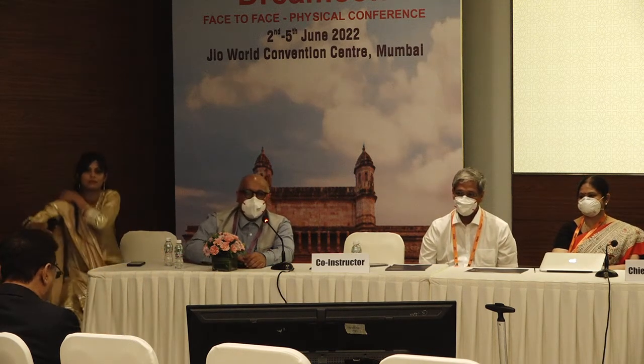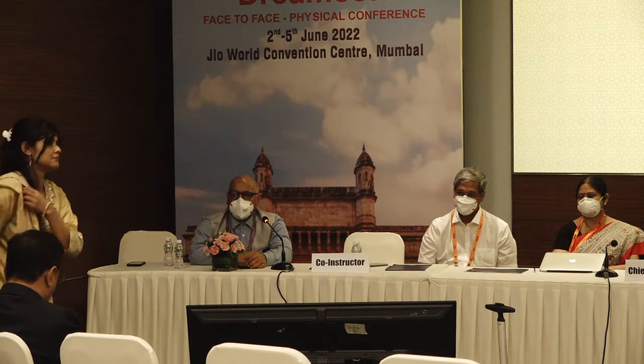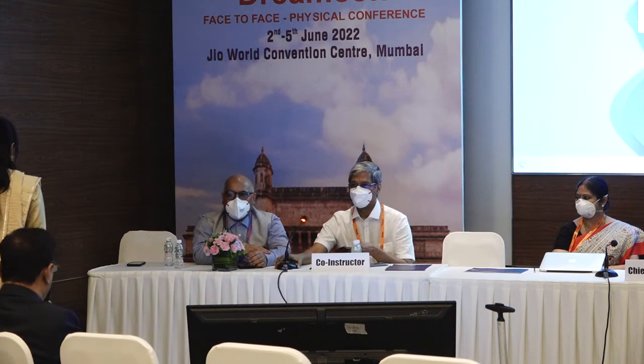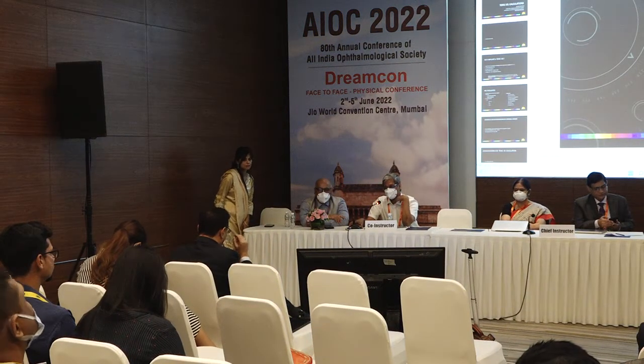I have one question. You had said in your post that post-RK, corneal thickness is not altered, so you would prefer a Zeiss topo or an OCT-based system. You can use any one, right? Yes, you can. You just need a measurement of a very small central zone, like 2 millimeters or so.